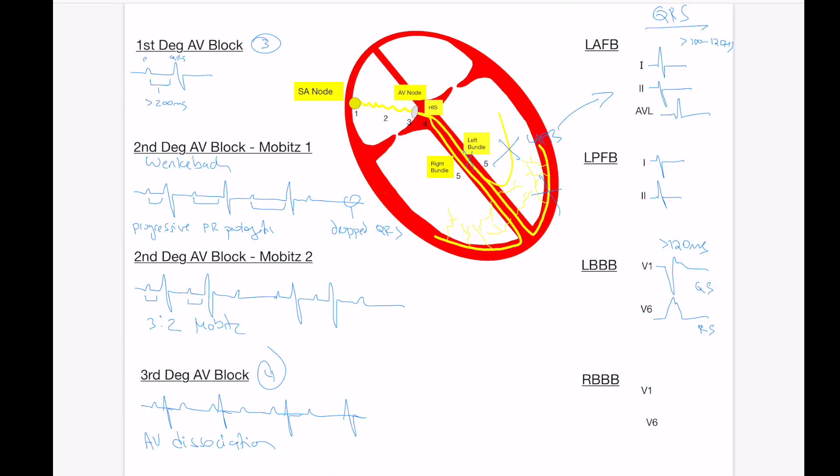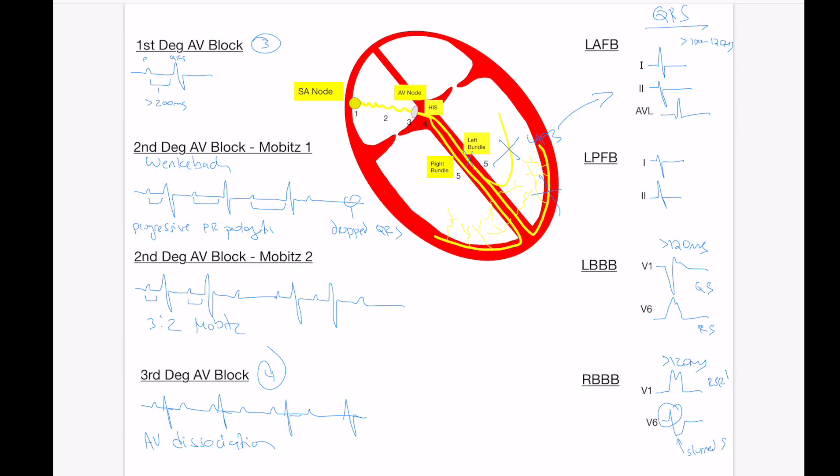A right bundle, on the other hand, again greater than 120 milliseconds, but in lead V1 it's going to be the opposite. In this case, you're going to get this RSR prime most of the time, which is like the bunny ears that we describe, where you're going to have a notch and a delay on the R wave. And in lead V6, what you're going to have is the slurred S wave. This slurred S wave often got me confused on what exactly it meant. Basically, this is occurring because most of the depolarization is rapid and early from the left side, and the slurred S represents the delayed depolarization occurring from the right bundle branch block.